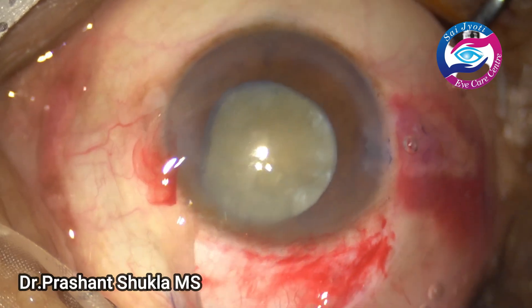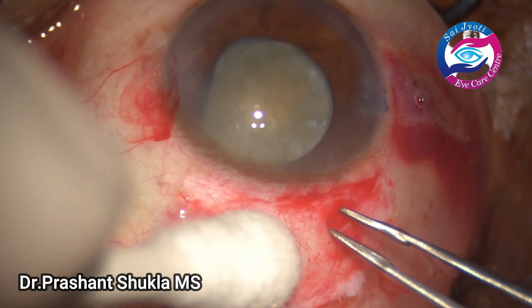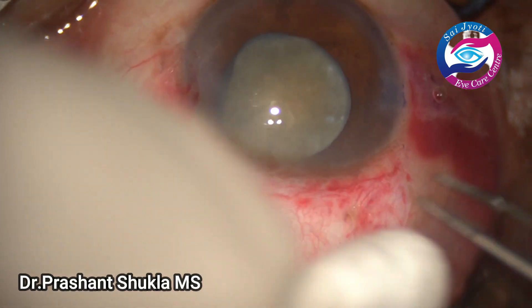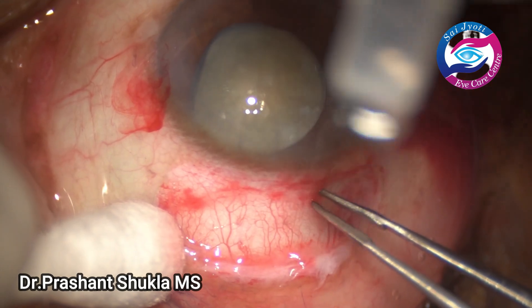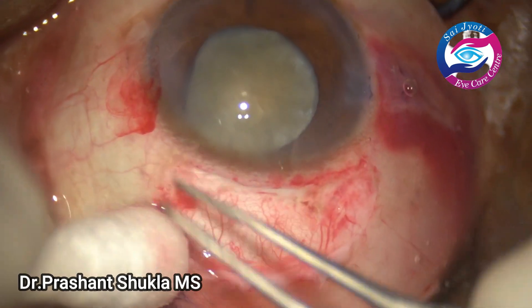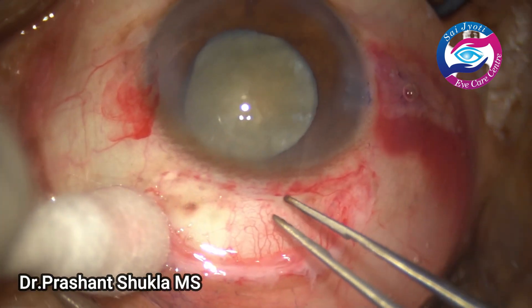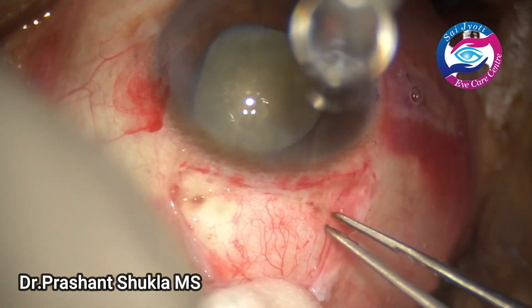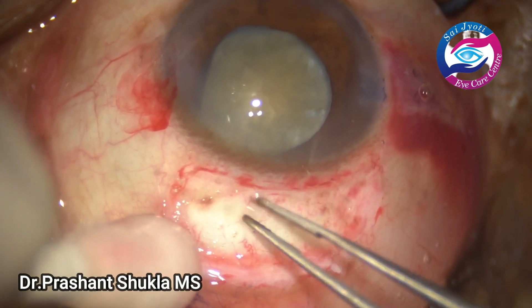I normally prefer making the rhexis first through the side port and then making the scleral incision, but beginner surgeons can do it as per their preference. Mild cautery is then applied using bipolar cautery.